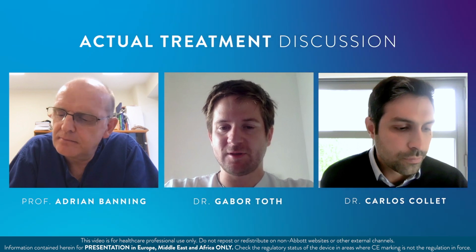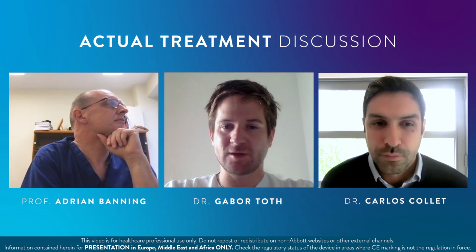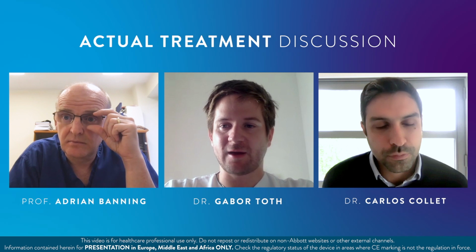Yeah, my question would be here. Actually, it's not even a question. It's more a comment that I believe that with imaging, you understood very well the extent of proximal dissection, and to what extent you need to stent proximally to cover it. I believe it was a confirmation of what we have seen on the angio and confirmed by OCT. I think here again post-PCI OCT might add some important information regarding how far you need to post-dilate and optimize the stent result.